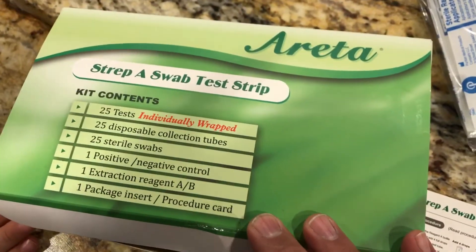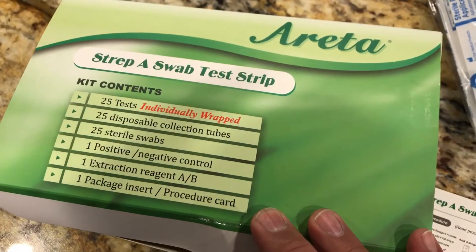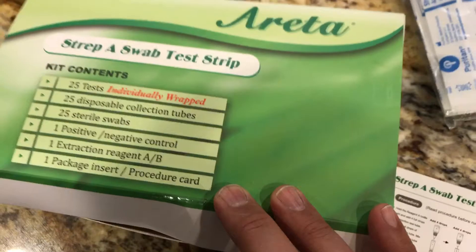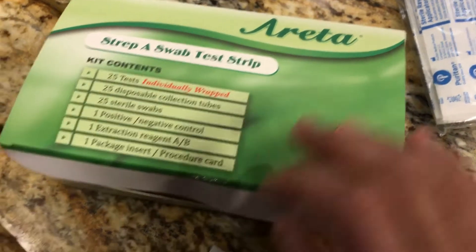My poor little man Connor has been sick the last couple of days, but I wanted to show you guys something that I think is very interesting. You can order this off Amazon — it's 25 tests, about 35 dollars, which is pretty cheap, a little over a dollar per test. You can do your own test for strep A at home, and it's pretty simple.